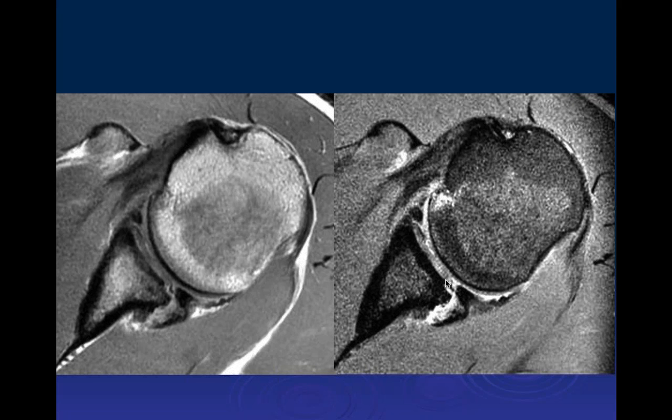Well, yeah. So what we're seeing here is a subchondral fracture, a tear of the labrum, displacement of the posterior capsule, and here is a part of the posterior attachment, but it's completely torn as well in this particular case. We also see that there's a little bit of edema anteriorly here. So what do you think caused this? Probably a posterior dislocation. Yeah, so I would be very highly concerned about a posterior dislocation, but here you've got a bone injury as well as an articular cartilage injury that might impact the prognosis and the treatment of the patient.